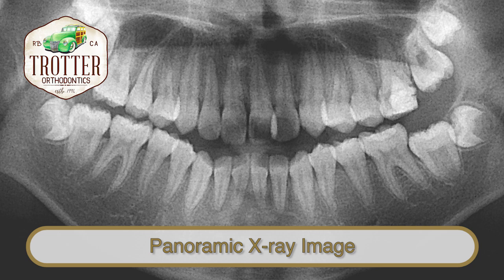Every orthodontic treatment starts with an initial consultation and a complete set of orthodontic records, including a panoramic x-ray.